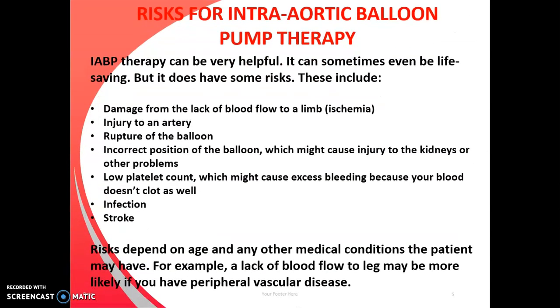IABP therapy can be very helpful and sometimes it can be life-saving. But it does have some risks. The procedure may reduce blood flow to your limb and injure an artery. Also, there is a chance of rupture of the balloon which is used. Incorrect position of the balloon may cause injury to the kidneys or other problems. The procedure may cause excess bleeding if the patient has a low platelet count.